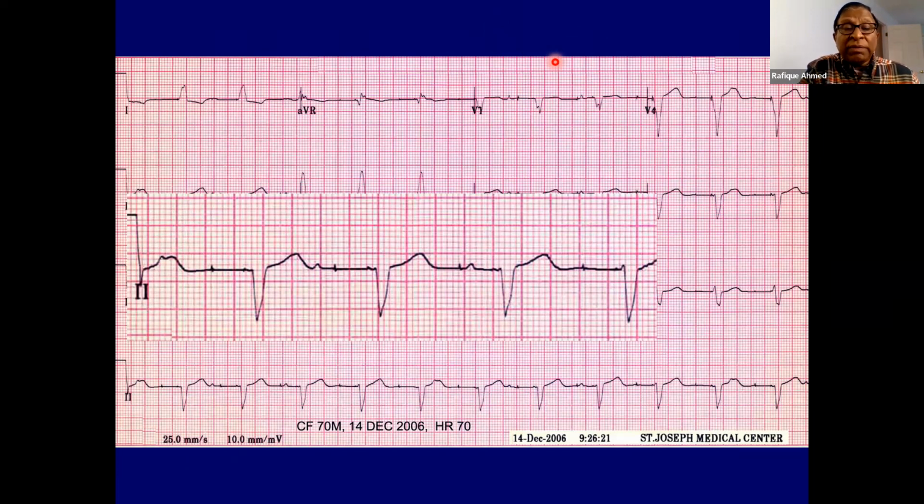Number two, let's say a 70-year-old comes to me totally asymptomatic, and the pacemaker has 2 years of battery left. What I may do, I will tell the patient, look, I know the atrial lead is not functioning, the ventricular lead is working, you are doing well. Let's wait until the battery runs out, and at that time I'm going to put a new atrial lead in. So that's an option. And the third will be, you can make a clinical decision after discussion with the patient. Look, just leave it VVI and the patient will do fine. Lead to extended life. Yes, exactly. But at that point, I'm going to program it VVI instead of DDD, because then it is going to waste battery for nothing.